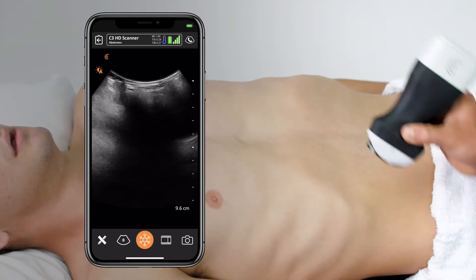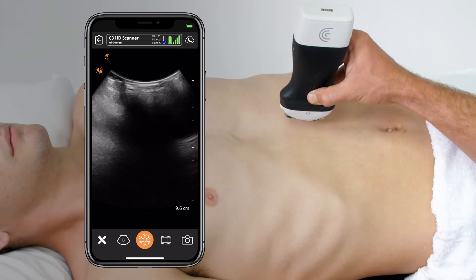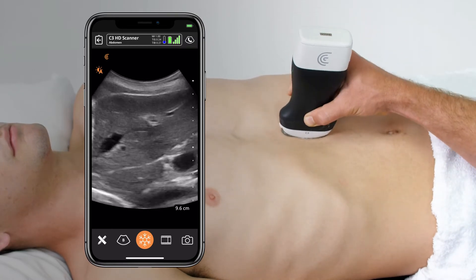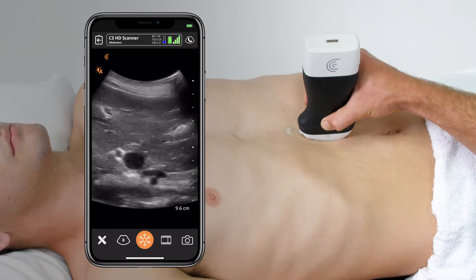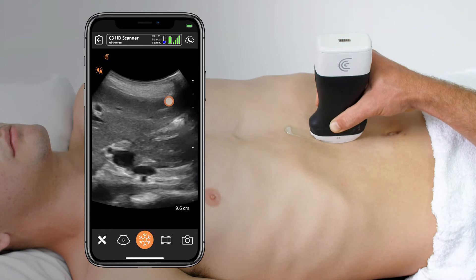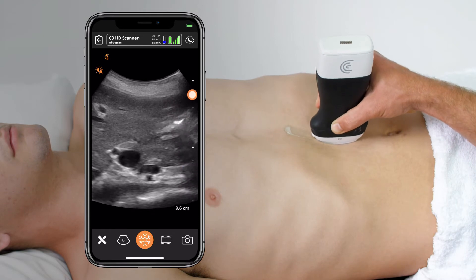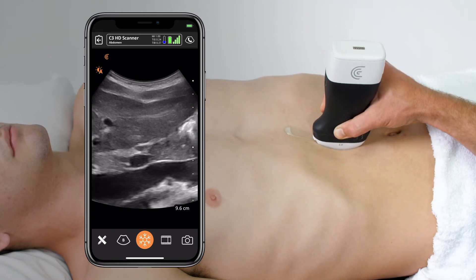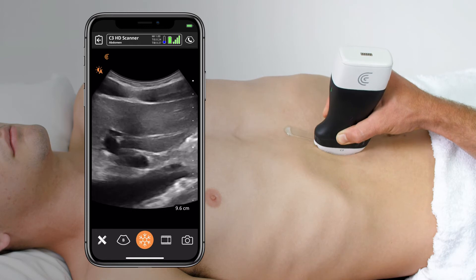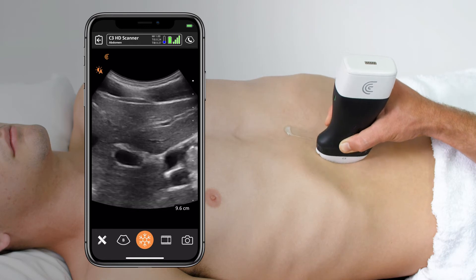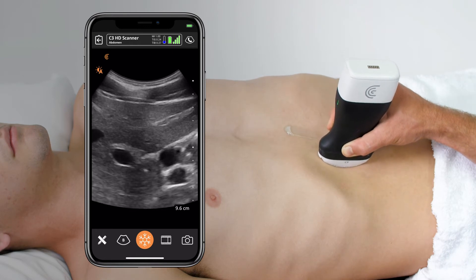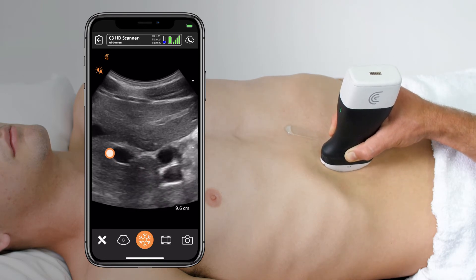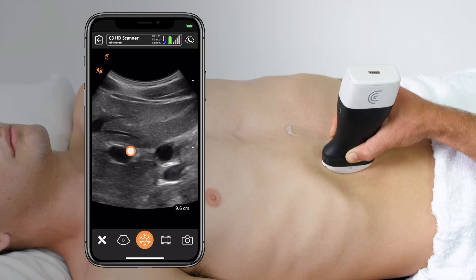I'll place it in the midline near the xiphoid process with the indicator towards the head to identify the liver edge. With it clearly in view, I can start sliding the transducer over to the patient's right until I can clearly identify the portal vein here, surrounded by a bright layer of fascia.